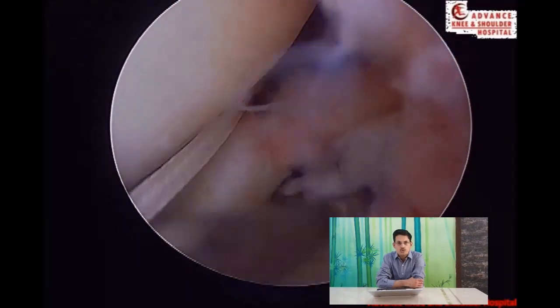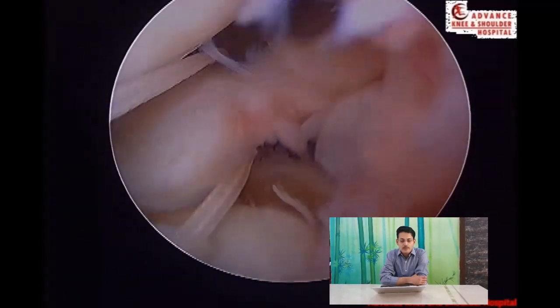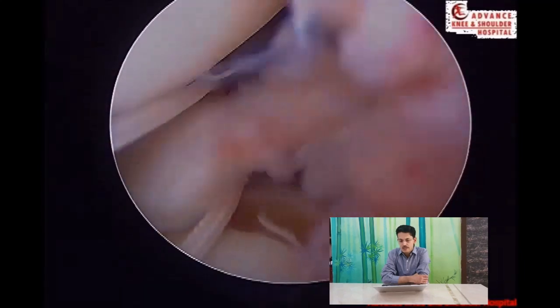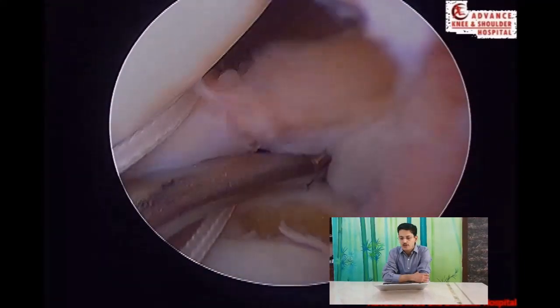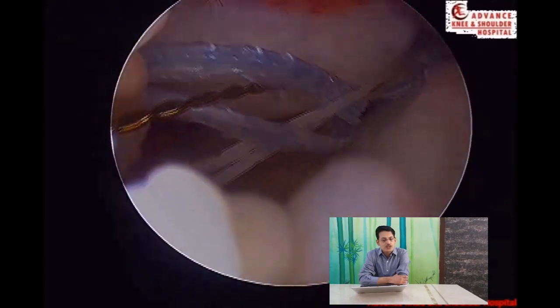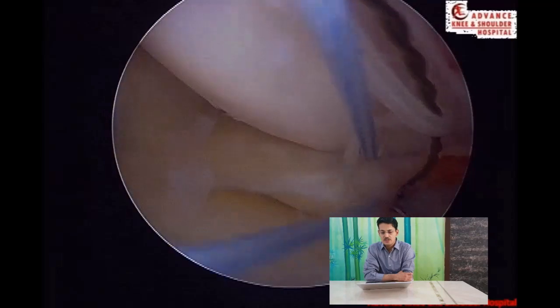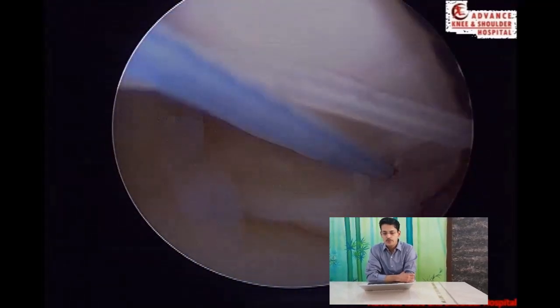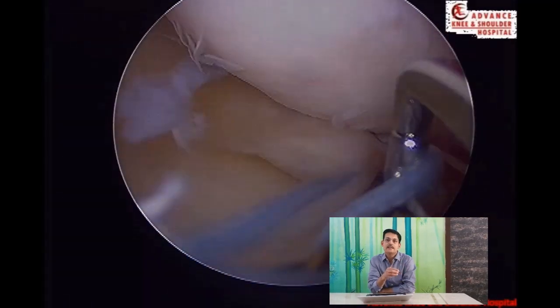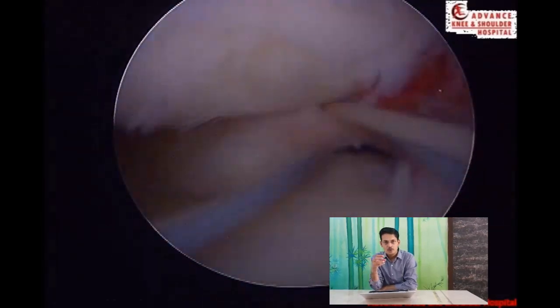This lady is 28 years old and a physiotherapist. If left untreated, she will end up with arthritic changes very fast, and this is not an age to do a knee replacement. We prepare the root, prepare the bony bed by removing cartilage at the desired portion — usually using a ring curette. Then suture management steps are performed sequentially: a suture lasso is passed, and over that suture tapes and fiber tapes are passed.